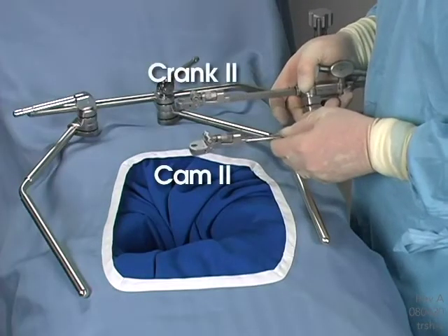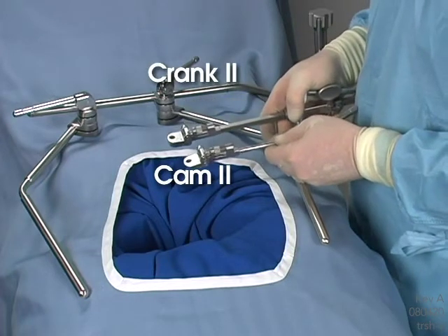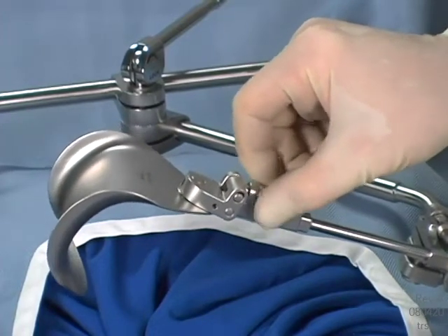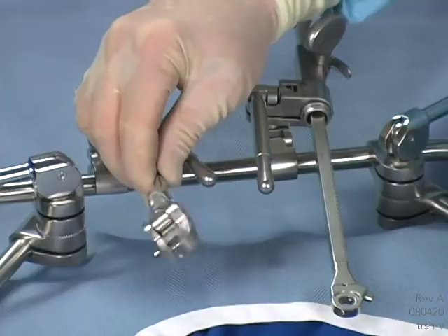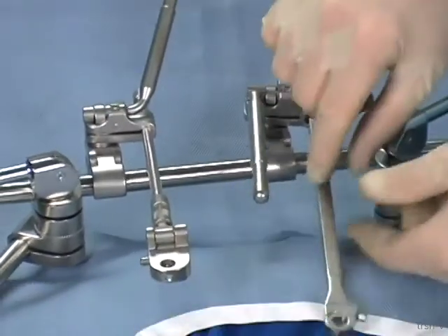Angling handles are available in both Cam 2 and Crank 2 clip-on joints. The angling handle allows simple adjustment of the blade angle. Without pressure on the blade, rotate the thumb screw to adjust the blade to the desired position. A hex bolt wrench is available to adjust the angle under tension. Note that both the Cam 2 and Crank 2 joints rotate for better positioning.